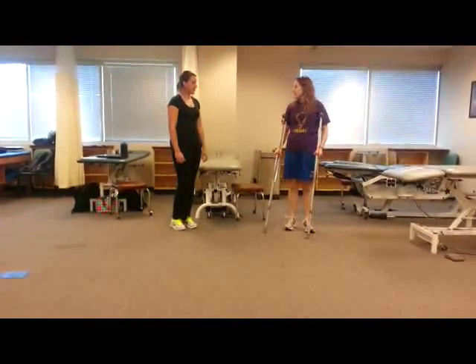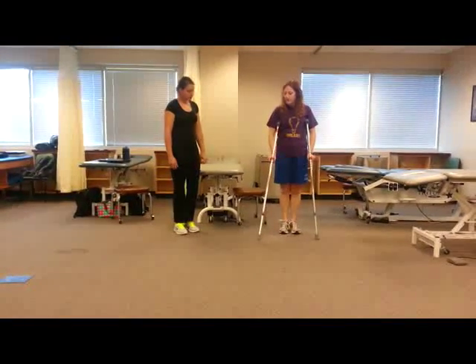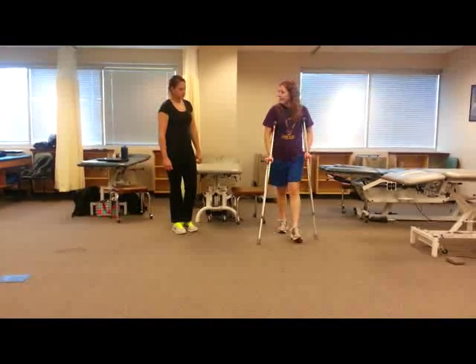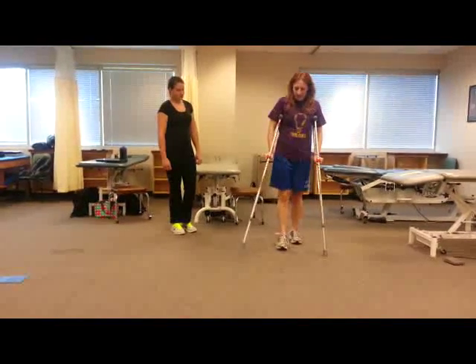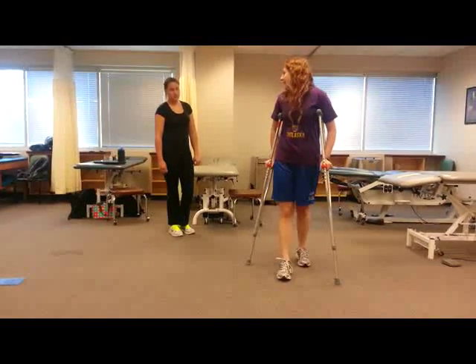The next one is a four-point gait. We're going to do our crutch first — it's going to look a lot like the two-point, except we just do the crutch by itself. Then our opposite leg. Then the other crutch. Opposite leg. Crutch. Opposite leg. Crutch. Opposite leg.